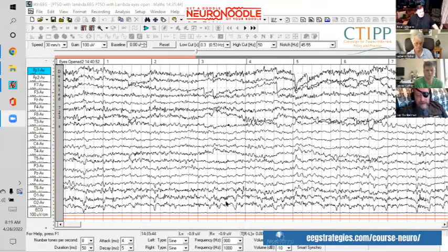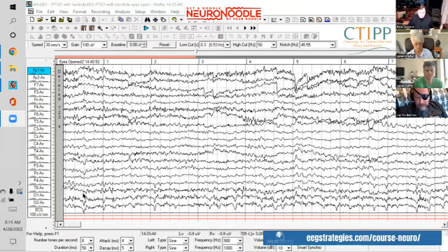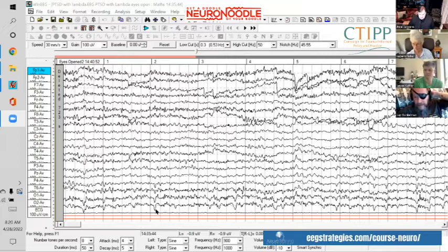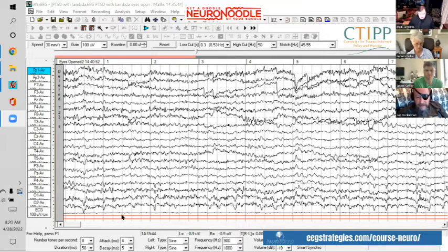What we have here is an individual with the eyes open. You can see there's eye movements — these frontal twitches, lateral and vertical eye movements. But I'd like to point to the back of the head. Every time you focus on something, you get a P100, a positive wave about 100 milliseconds later at the back of the head. If you're emotionally charged, it gets there early, and it gets there big. And we end up seeing these positives down in EEG land — you can see these waves.